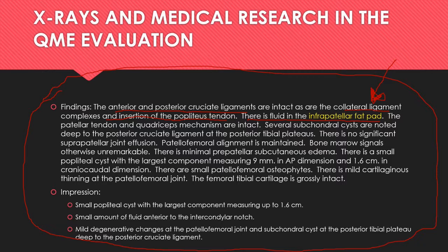and so these are describing some minimal degenerative changes and other painful findings, such as fluid in the infrapatellar fat pad, fluid in Hoffa's fat pad, which is associated with fat pad impingement, and that is a painful condition. And this fluid in the infrapatellar fat pad is something that we're going to see rear its head later on that's going to impact our opinions and conclusions.